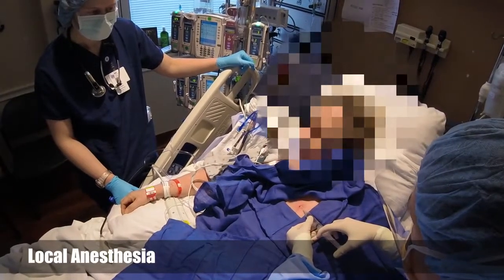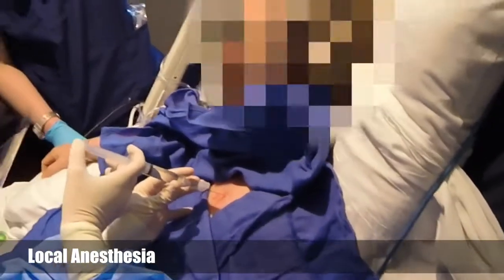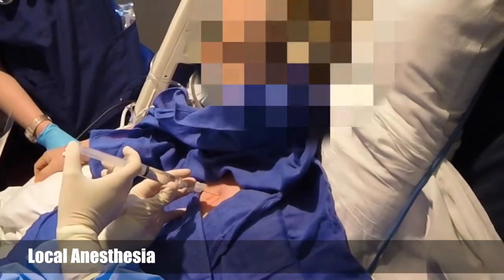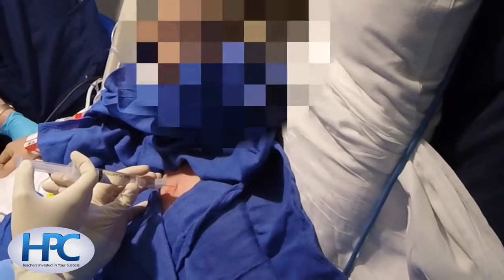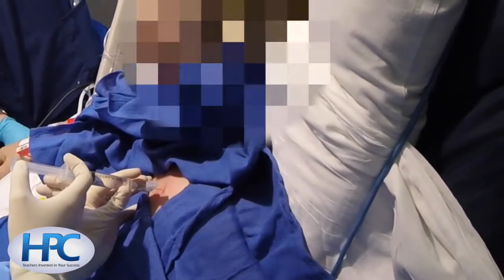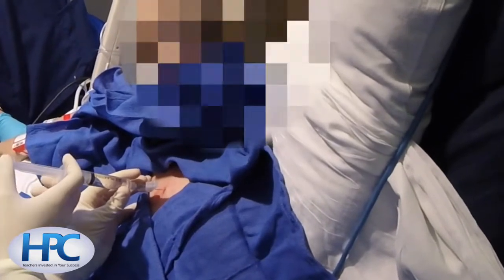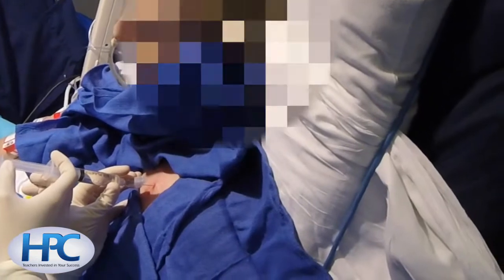We're using 1% lidocaine for local anesthesia of the skin, and we are gradually inserting and then aspirating to make sure we're not in the pleural space before local anesthesia of the subcutaneous tissue. As we insert the needle, we are constantly pulling aspiration to make sure we are not in the pleural space.